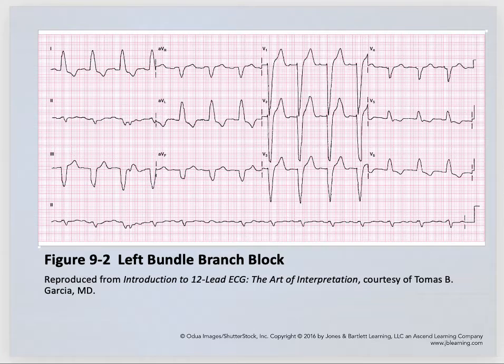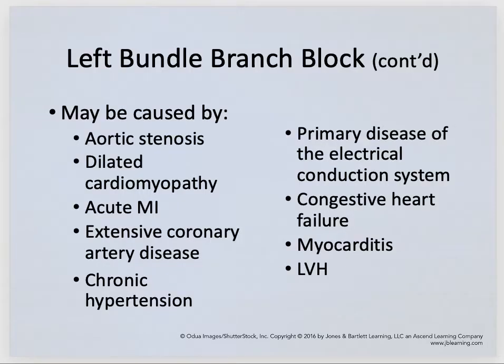What else do I want to remind you of? We can take a look that we're not in normal axis deviation, right? Lead 1 is positive, lead aVF is negative, so that's not normal quadrant. Remember, how do you tell axis? You look at what's going on in lead 1, meaning positive, double thumbs up, right? Positive in this lead, but in our aVF it's negative. So it would be a not normal axis deviation.